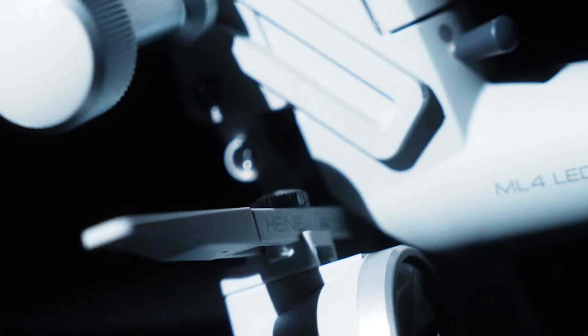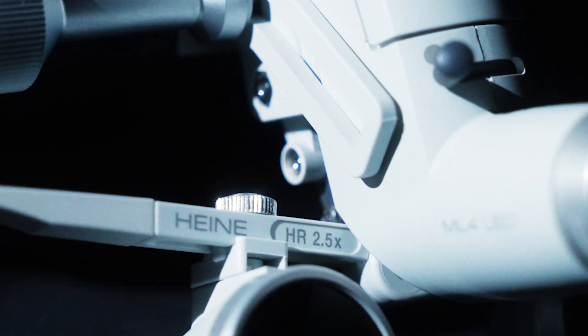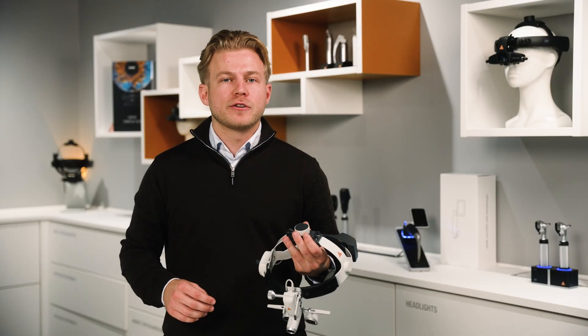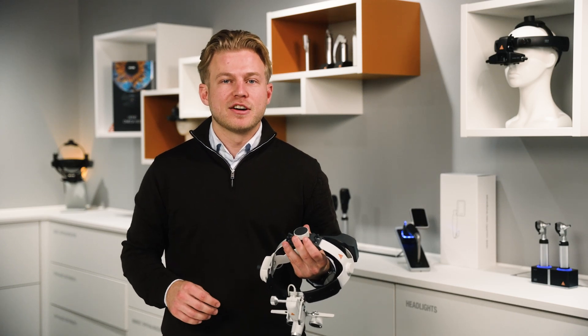With the Heine binocular loops you have the choice of different magnifications: 2.5, 3.5, 4, and 6 times magnification, as well as different working distances. Find all available loop configurations and specific technical features about the ML4 on our website, Heine.com.